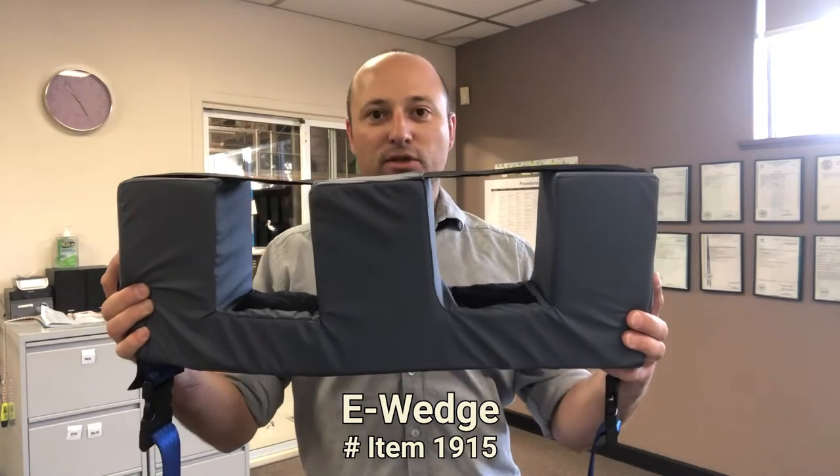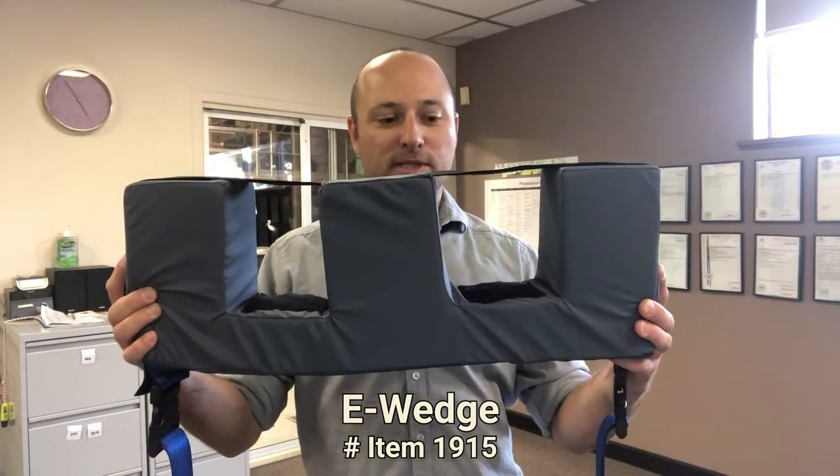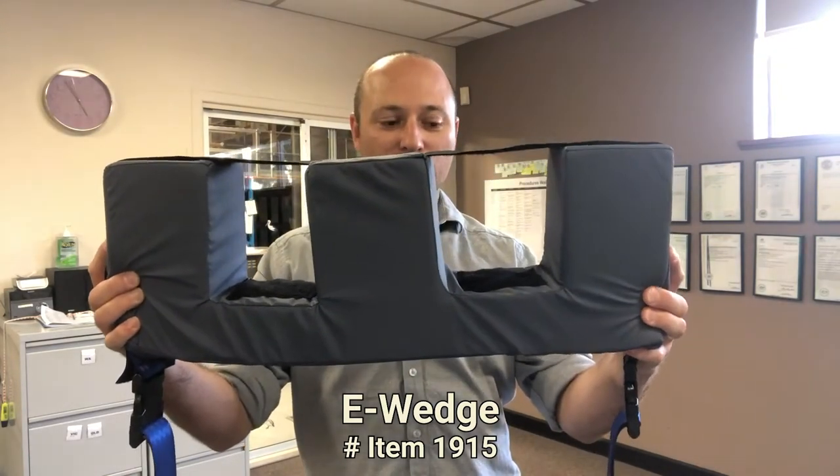Hi, it's Tom here from Pelican with some information on the new eWedge product. This can be used as part of a more complex sleep system, or can just hold the legs on its own.